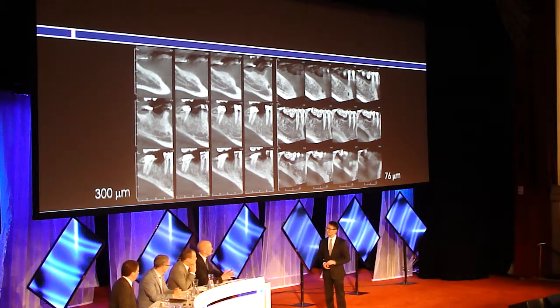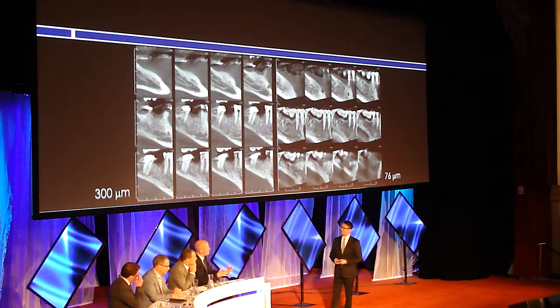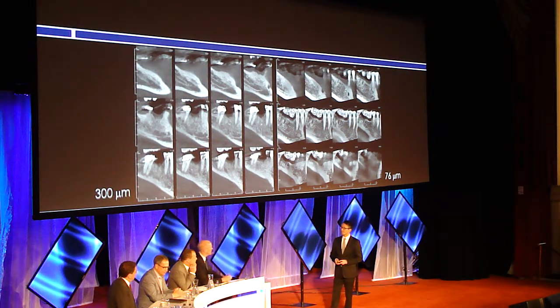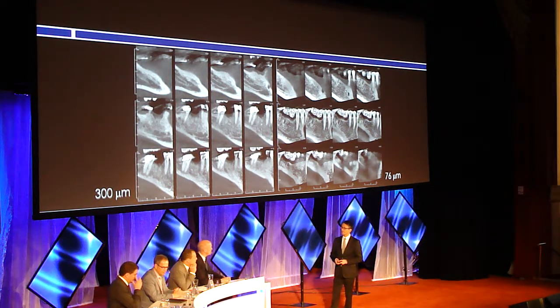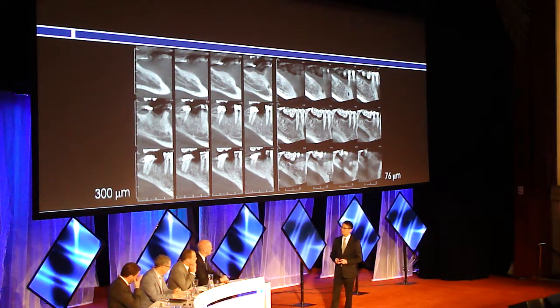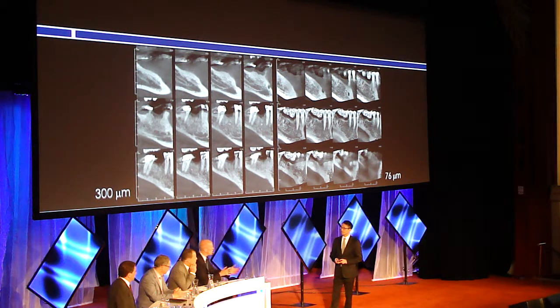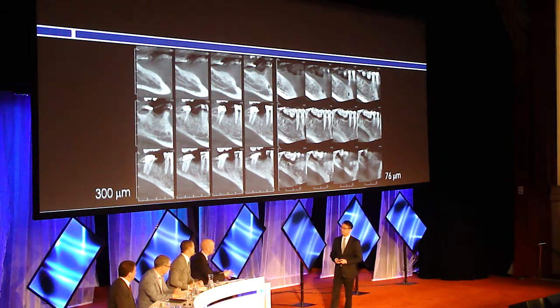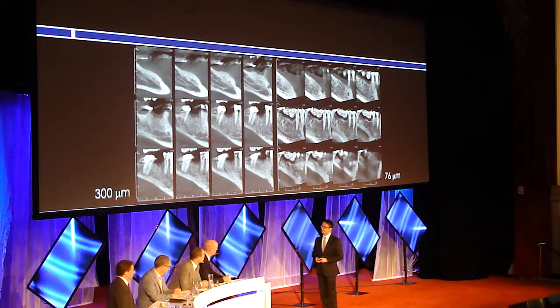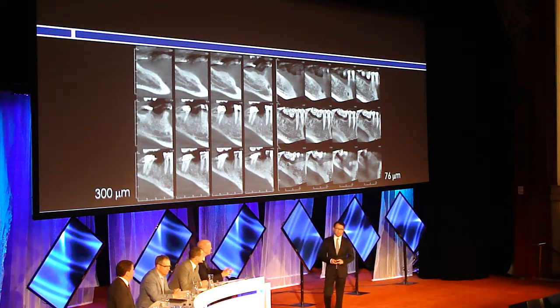When I ask a question in regards to differentiating getting enough information from this, and as we've discussed before, there are certainly questions from the patient: what is the radiation exposure? It's in certain media, it's certainly a big topic to make patients aware. So how can we answer this? Should we always go for a small field of view, or does it matter in regards to the resolution we need? So how does this correlate now? And what is my best option that I have today?